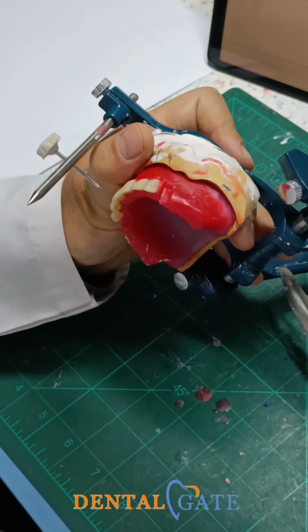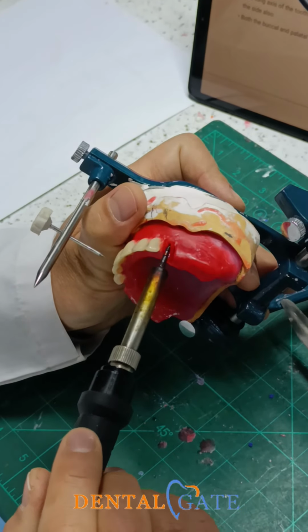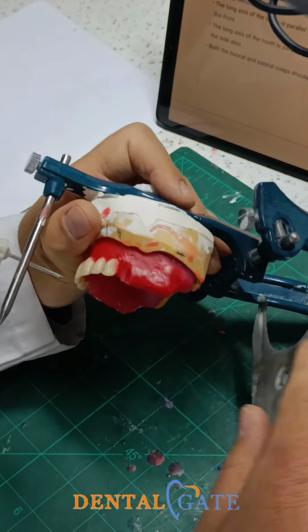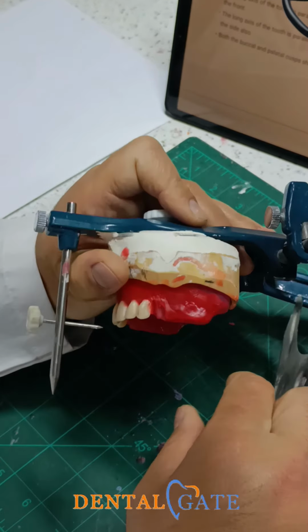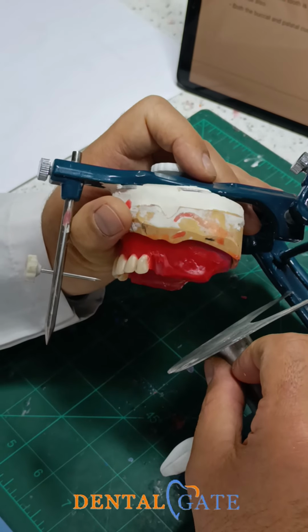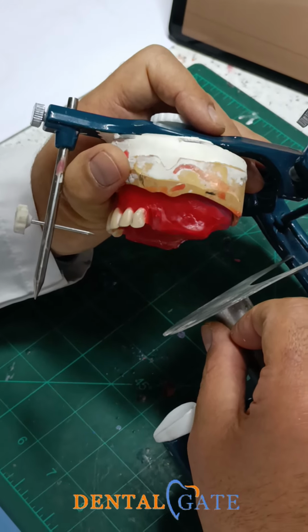So, my objective now is to put the premolar to have a proper relationship with the table that represents the occlusal plan. After that, when I remove my table, the posterior should make occlusion according to the upper. So the upper, we have already had the criteria. We had a curve.